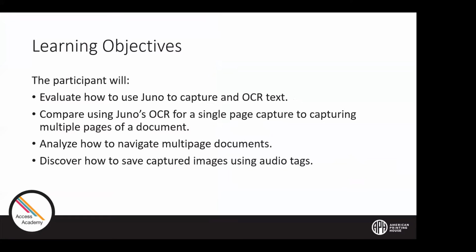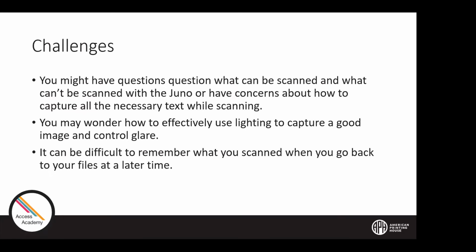You'll start seeing how those audio tags will help you know what you have and keep better track of them. Some challenges, perhaps some things that have been troublesome to you. You might have questions. You might want to know how you can scan or specifically what you can and cannot scan with the Juno, or have concerns about how to capture all necessary texts while scanning. You may wonder how to effectively use lighting to capture a good image and control glare. And it can be difficult to remember what you scanned when you go back to your files at a later time. And we'll see how audio tags are very helpful with that.